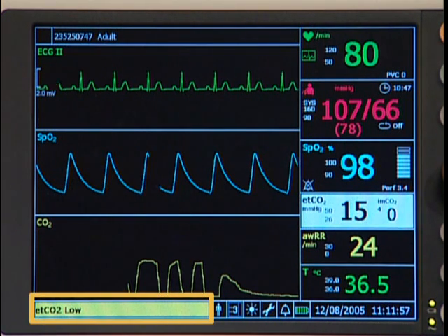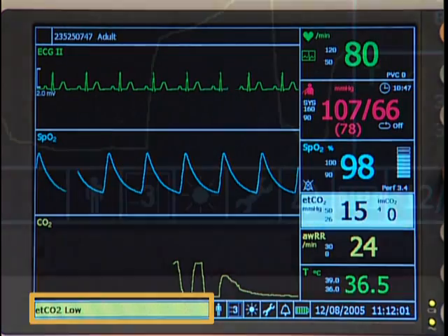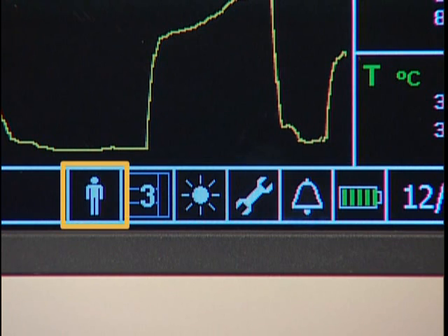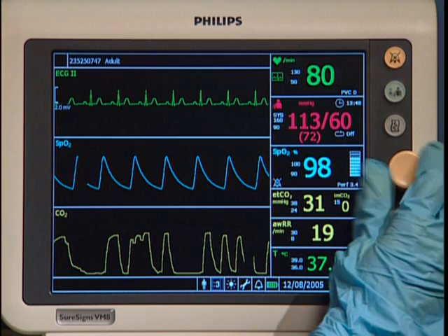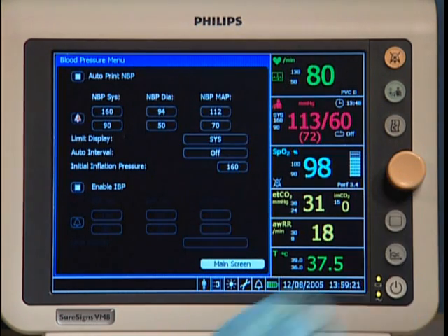This message area displays text descriptions of any active alarms. These menu icons provide access to menus that control various system settings. This button is used to admit a new patient or to change the patient type. This is the navigation wheel — rotate it and notice a highlighted area moves around the screen.